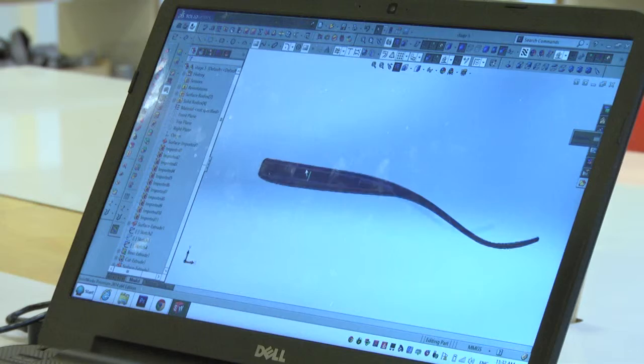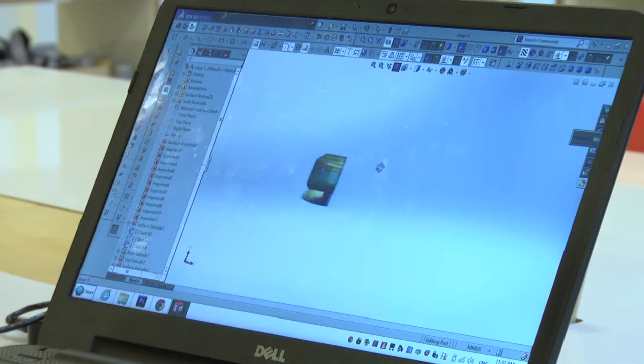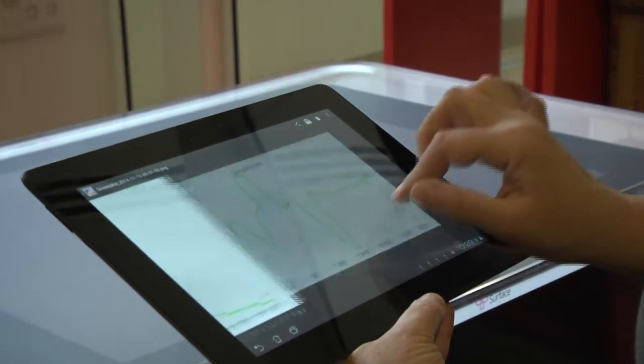We talked to therapists, analyzed videos of children eating, and created several models until we reached the current spoon design. Our spoon can assess a child's ability and monitor his progress. Complex measurements such as movement fluency or rotation can be easily measured and recorded for tracking over time.